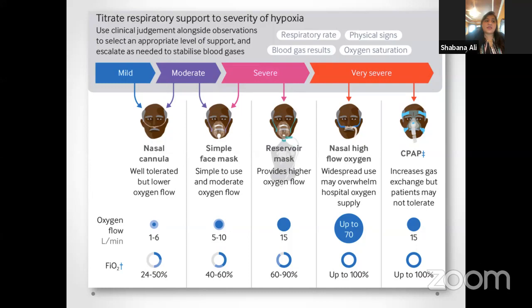The rebreather mask is extremely important because the flow is never set lower than 5 liters per minute. This is very, very important. We have seen sometimes the nurses hanging those masks, but they are not setting the liters of oxygen to a proper amount. You need that much flow to flush the exhaled carbon dioxide, which is in the mask, out. Otherwise, the patient will be rebreathing his own carbon dioxide all the time.